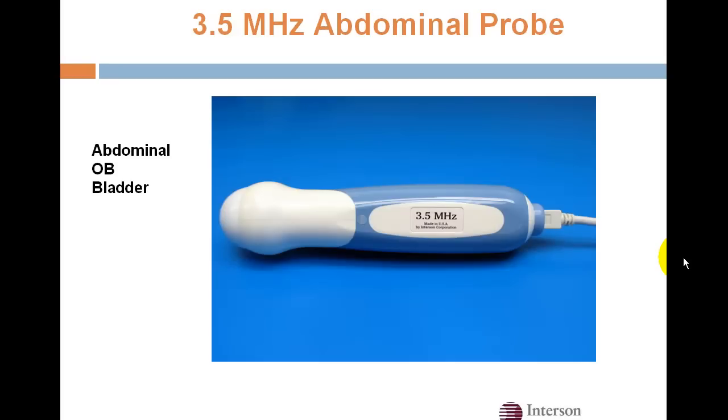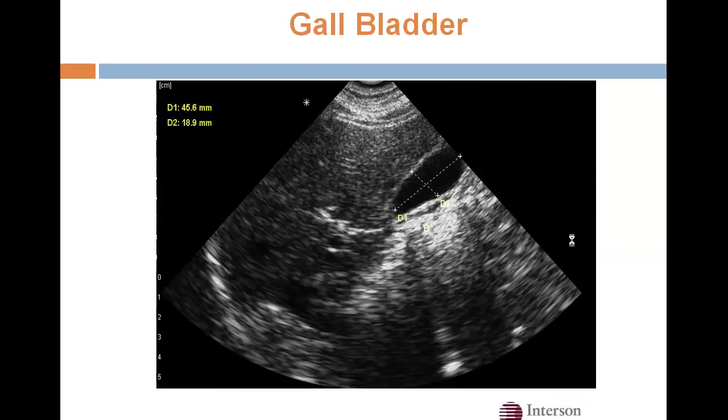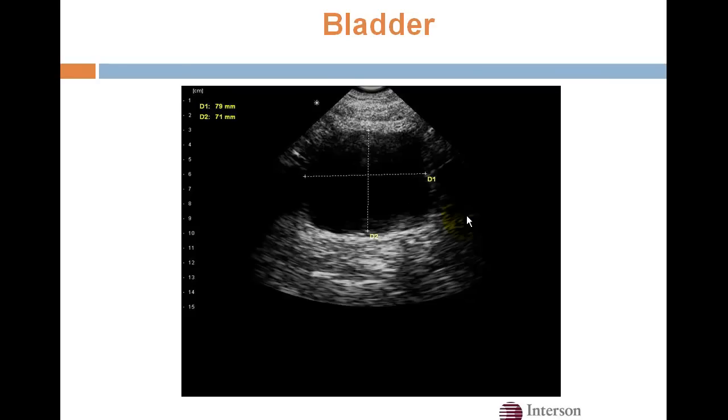This is our 3.5 MHz abdominal probe, which is optimized for abdominal scanning. Here is a liver and a kidney. We can actually do measurements — here are two measurements on the gallbladder. We can also measure post-void residual bladder volumes with our system and automatic calculation software.